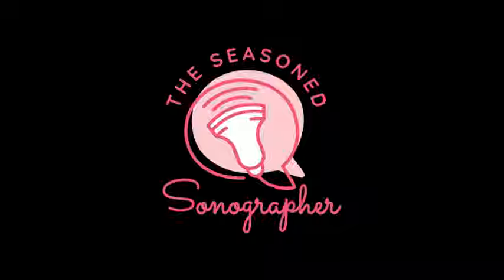It is the empty space that contains cerebrospinal fluid behind the cerebellum to the fetal skull. So you would measure from the vermis of the cerebellum over to the fetal skull. It should be less than 1 centimeter. The measurements of the cerebellum and cisterna magna are essential for a standard fetal anatomy scan and assessing normal brain development.